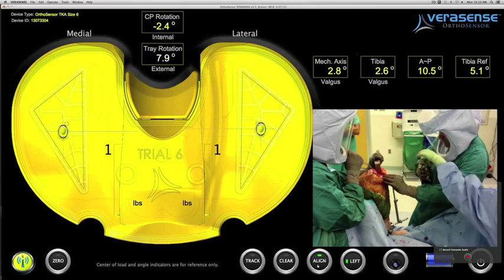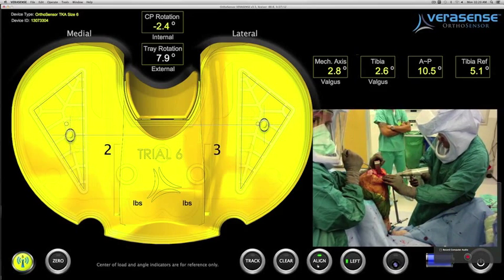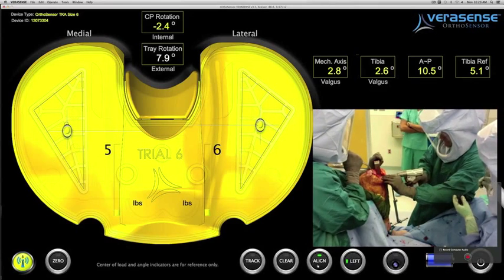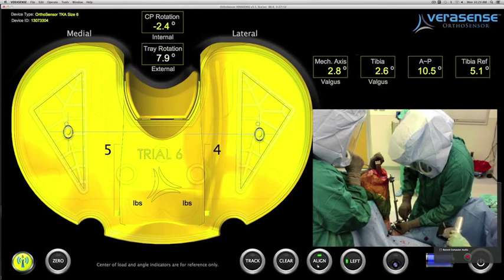The surgeon has the opportunity to refine his cut on the tibial side and to add more varus to make the cut more neutral, which should potentially improve the soft tissue balance on the medial compartment.